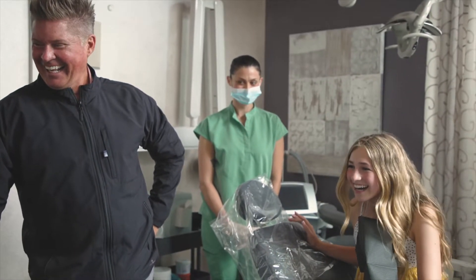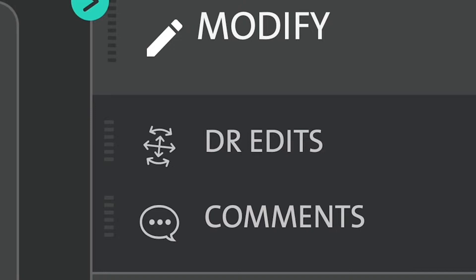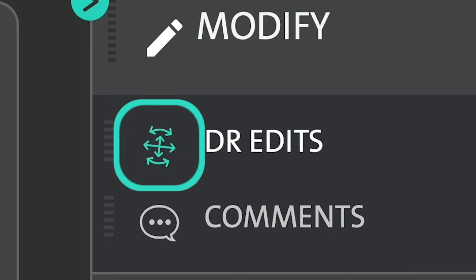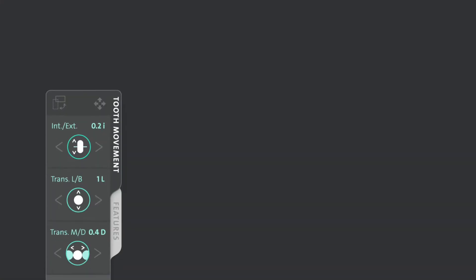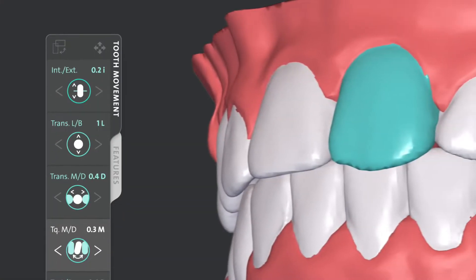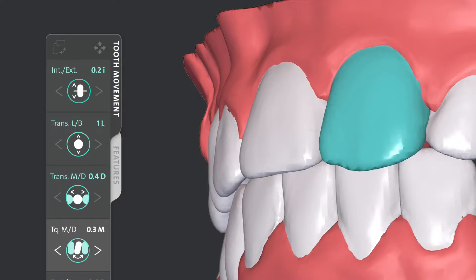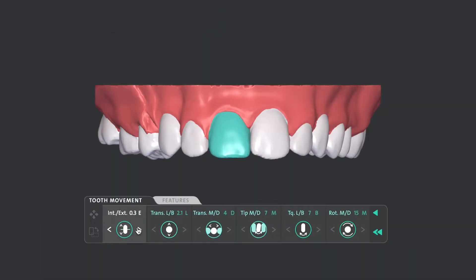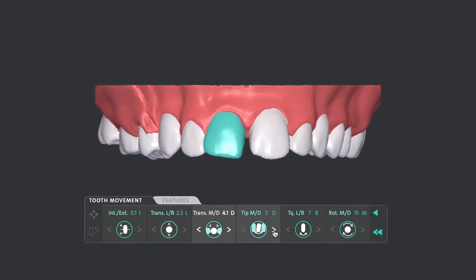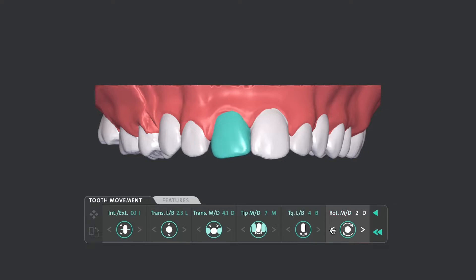If you're a clinician who prefers a more hands-on approach, ClearPilot offers 3D controls to change the final position of the teeth directly on the 3D model. With the ability to prescribe exact movements for intrusion and extrusion, translation, crown tipping and torque, as well as rotation, your patient's treatment is always in your control right where it belongs.